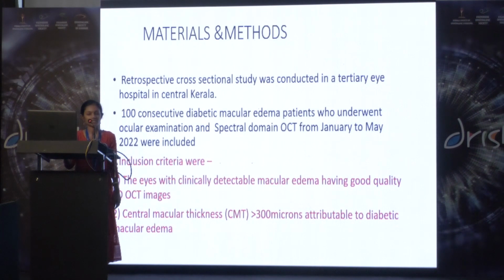The materials and methods: it was a retrospective cross-sectional study conducted in a tertiary eye hospital in central Kerala. 100 consecutive diabetic macular edema patients who underwent ocular examination and SD-OCT from Jan to May 2022 were included.